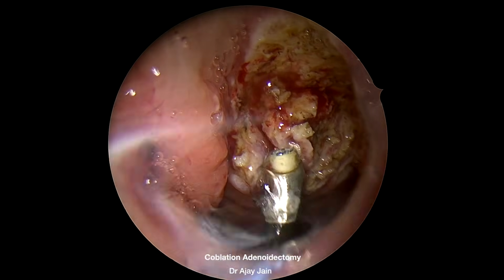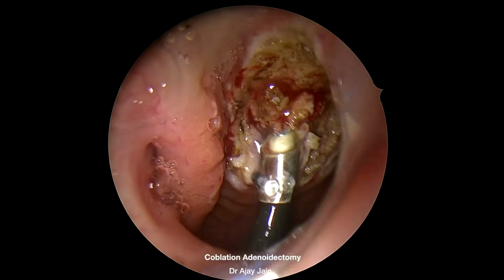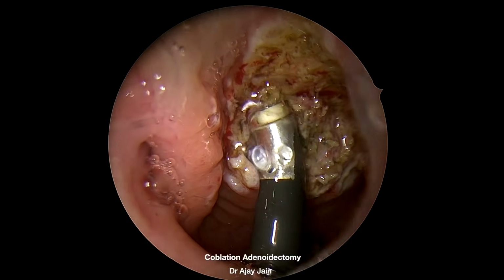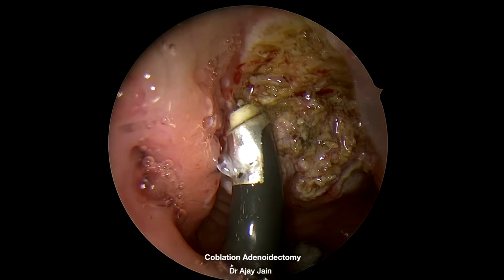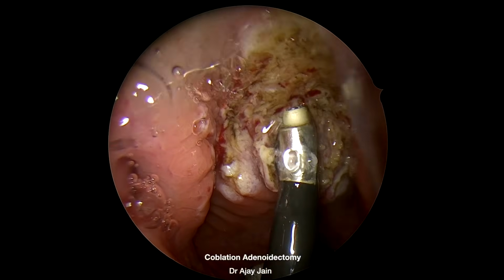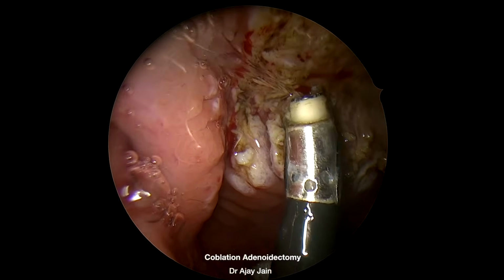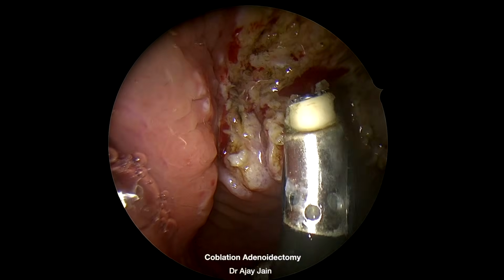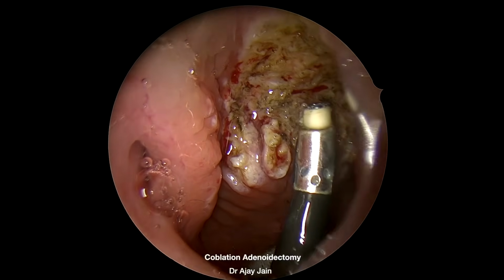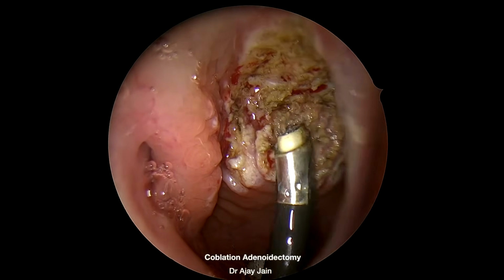Now this side adenoid tissue. First I am lifting the adenoid tissue, then I am ablating those. You can clearly see the superior boundary nicely. Then don't keep the wand on one place, keep slightly rotating it. Otherwise too much thermal energy at a single point may cause thermal damage and charring.